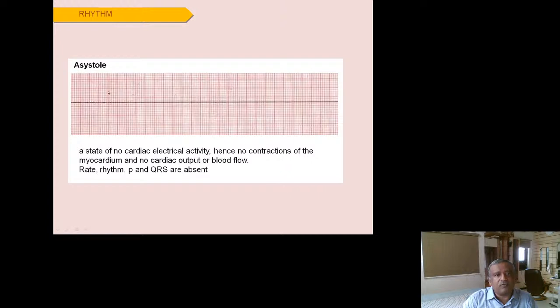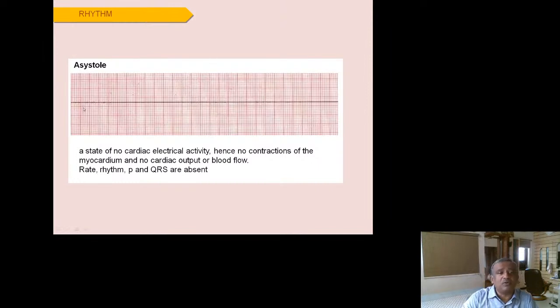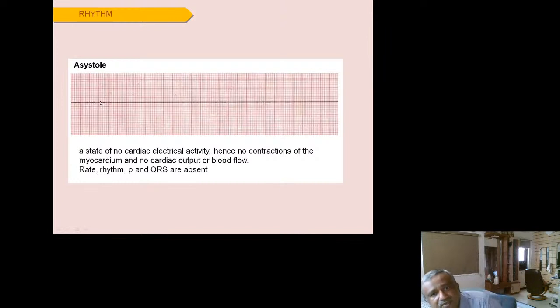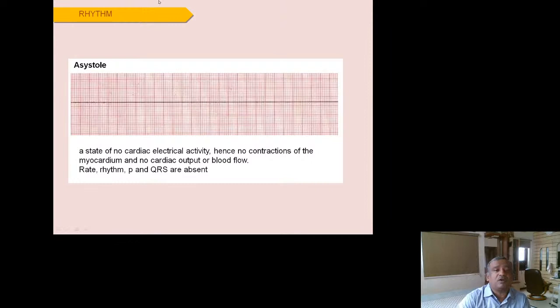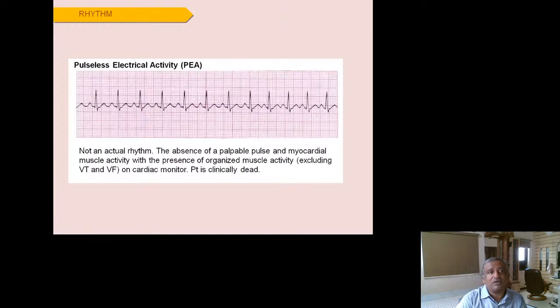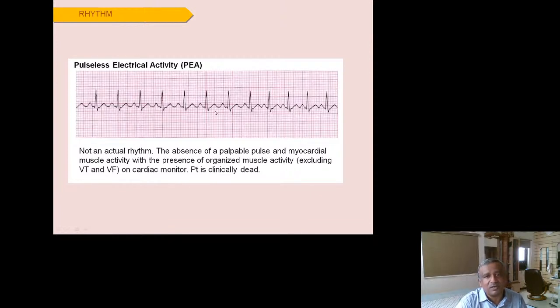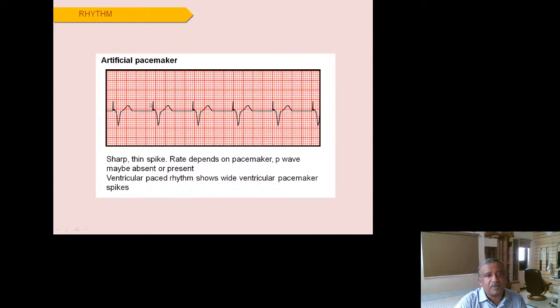Asystole is the total absence of cardiac activity — a flat line. Before diagnosing asystole, ensure the limb leads are properly attached and this is not an artifact. Pulseless electrical activity (PEA) can occur where a rhythm is present but the patient has no pulse — sometimes pacemaker activity continues even after death. When an external or internal pacemaker is inserted, you will see a pacemaker spike followed by a somewhat wide QRS complex and T wave rather than a typical P wave.